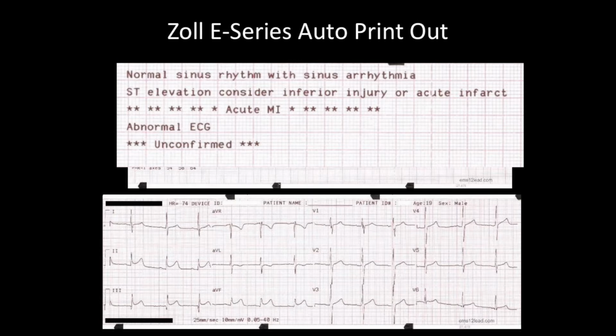But what I want you guys to think about is, we're moving. You're moving, you're not delaying. People always say, well, you're doing the 12 lead, you're gonna delay care, right? There are these typical statements that are made when you do this, and I just don't wanna get into that realm. So I want you to do them and move, but I want you to consider helicopter service for a STEMI, that is appropriate. And I want you to move toward ideally a PCI center with this patient.